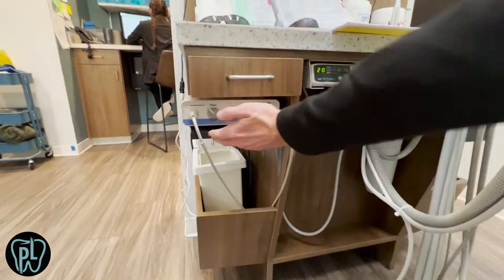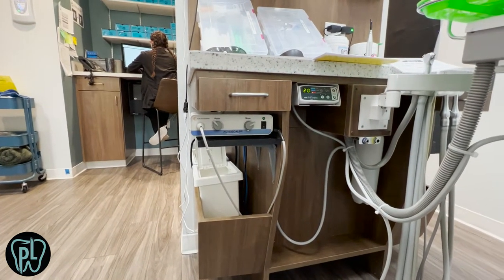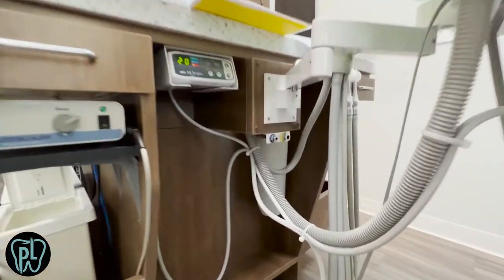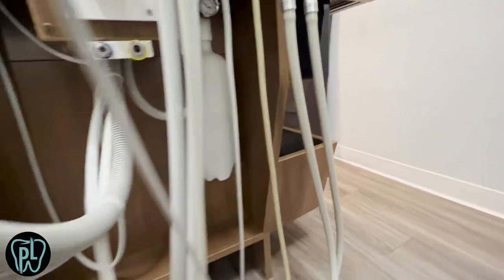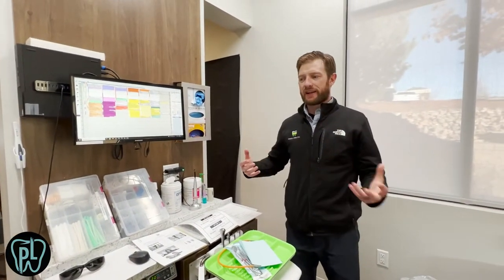Right here we have a Cabotron set up so we can do hygiene in any room at any moment. If we had a patient in here sedated, they could just pop in the quick release to the water and get going. We use the water bottle system, which is the preferred system these days. We put tablets in with sitting water, which helps save the equipment and saves on plumbing costs.